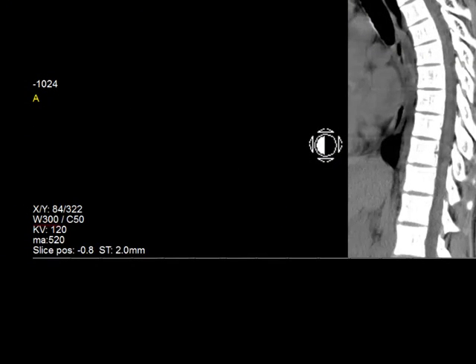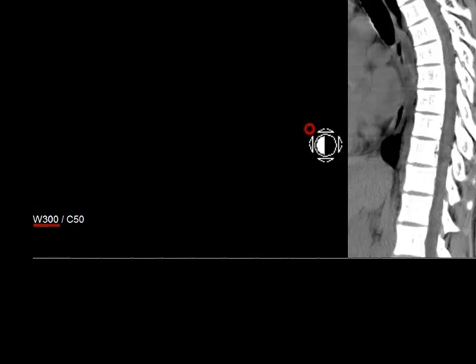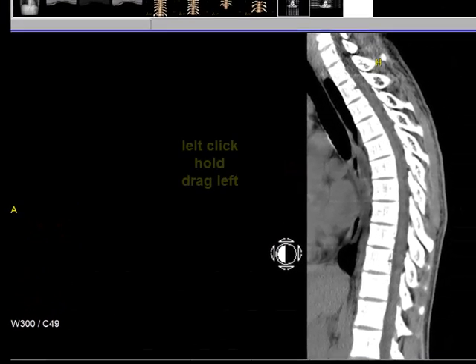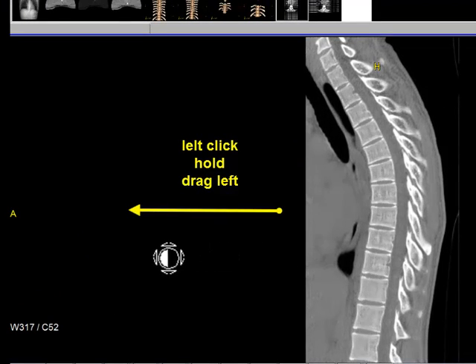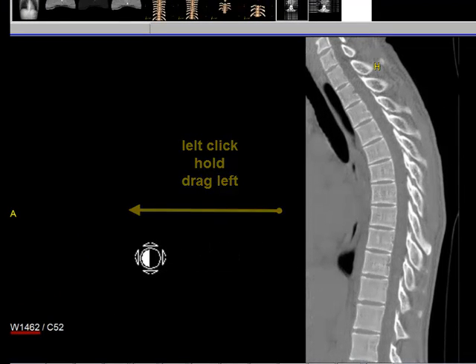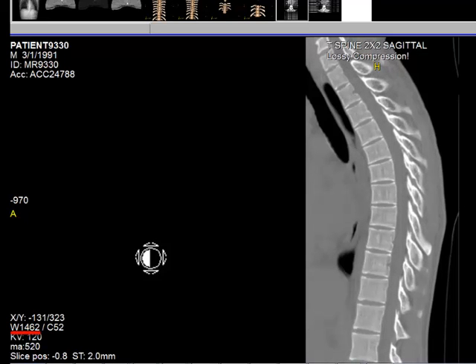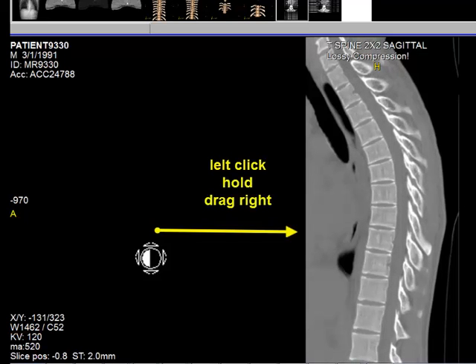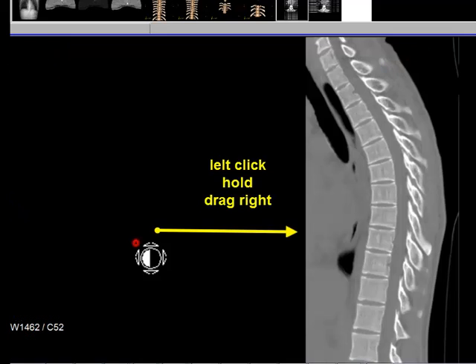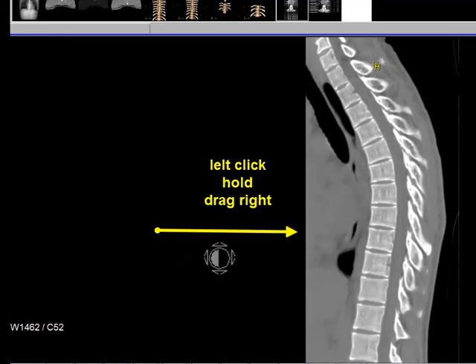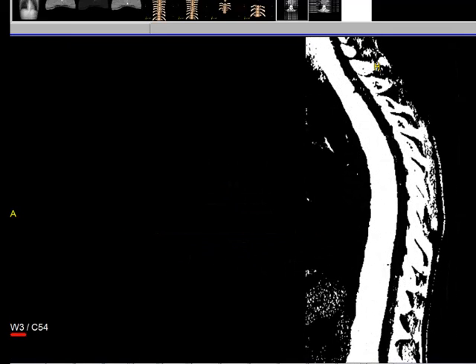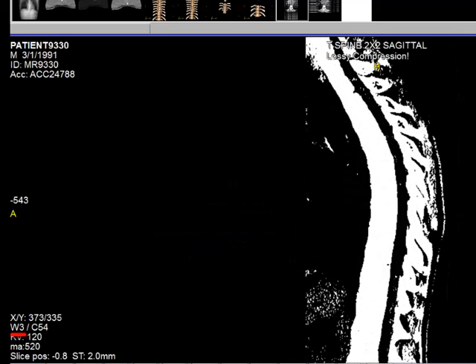I now have a width of 300. If I left click, hold, and drag to the left, you notice that the number gets much higher — in this case I have gone up to 1462. If I left click and drag to the right, you notice that the number gets smaller and it goes down to a width of 3.